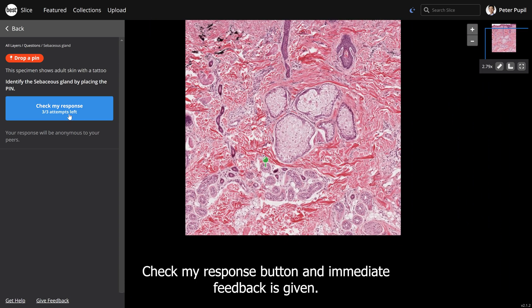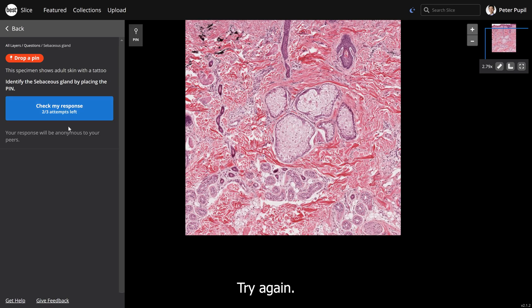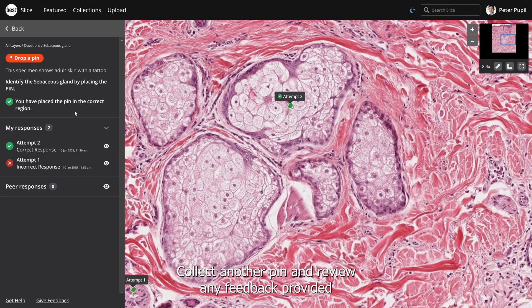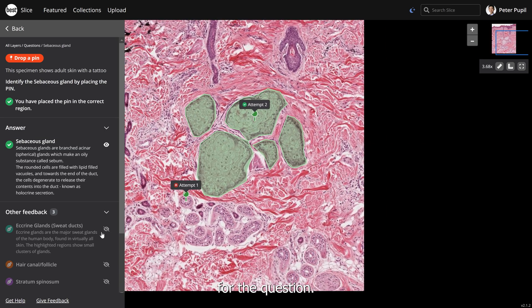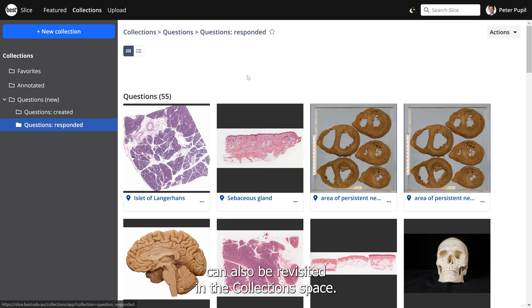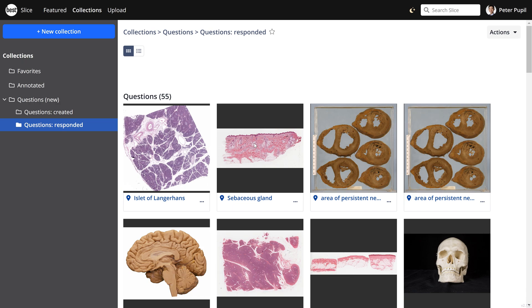Click the blue Check Your Responses button and immediate feedback is given. Try again by collecting another pin and reviewing any feedback provided for the question. Questions you have answered can also be revisited in the collection space. You can return to Slice at any time and find all of your resources there.